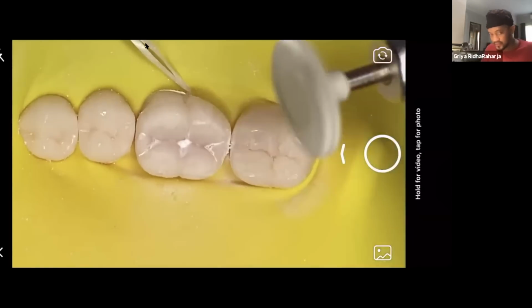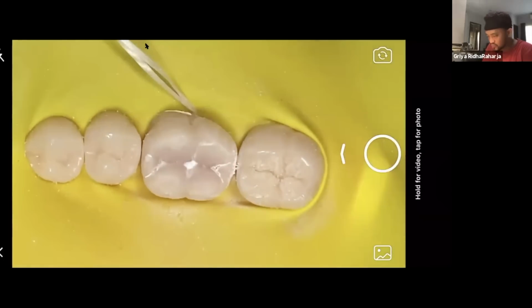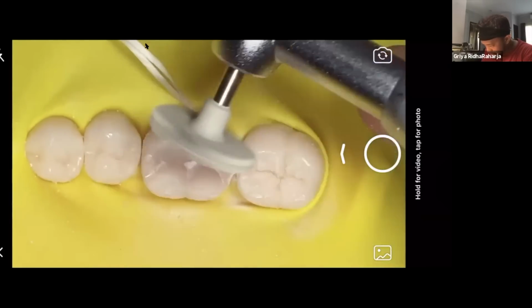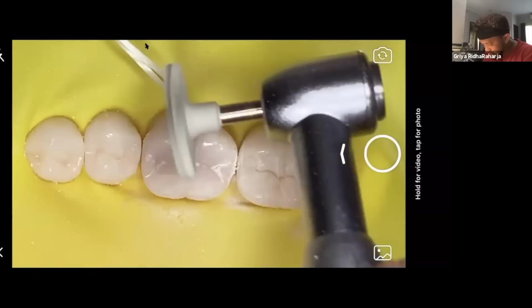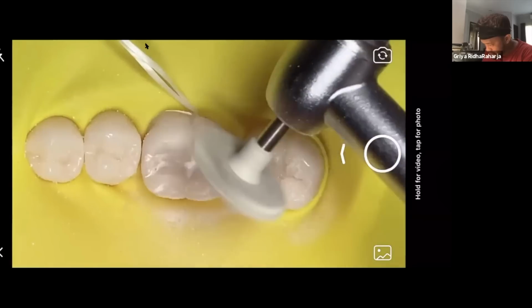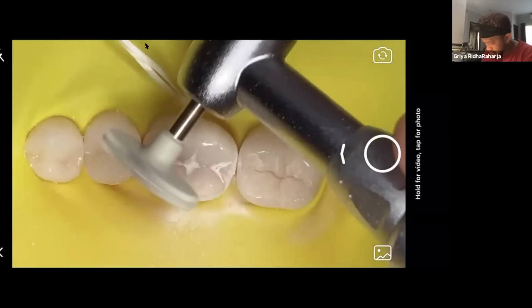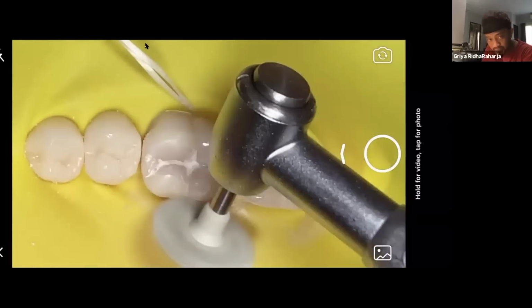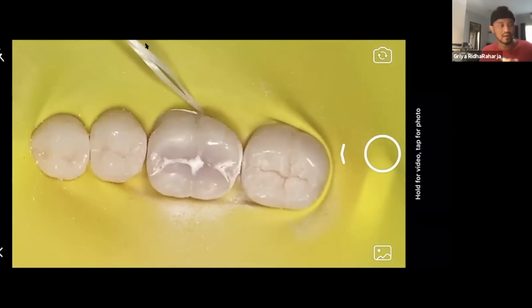And then the last is the gray one. Yeah, you need high speed because you want to make it glossy. Okay, the central part is okay. Yeah. After I remove the dust, yeah, it will be nice. Okay, it is like magic.